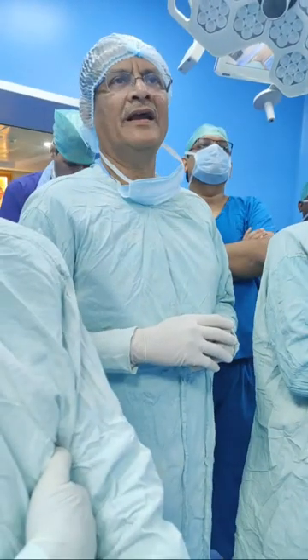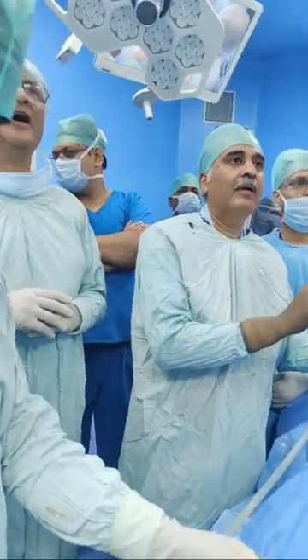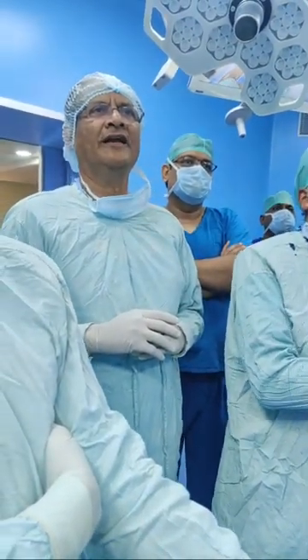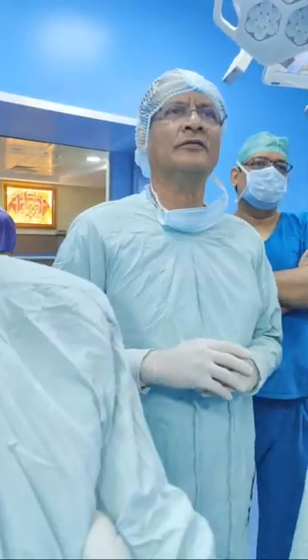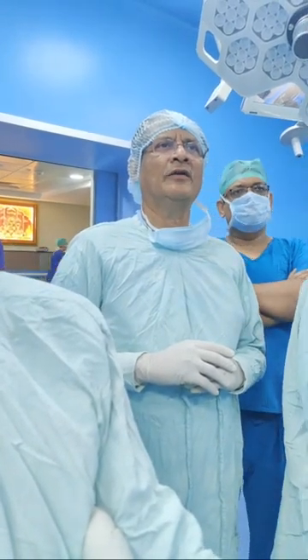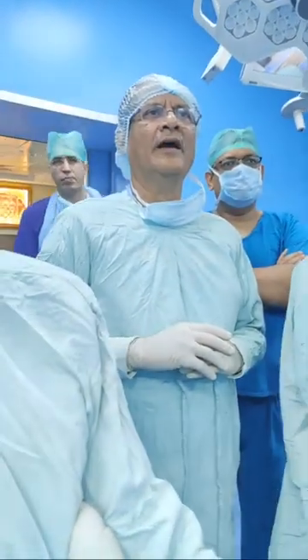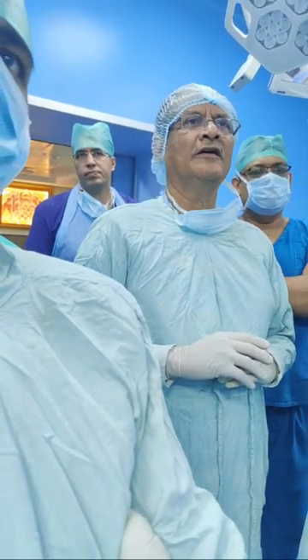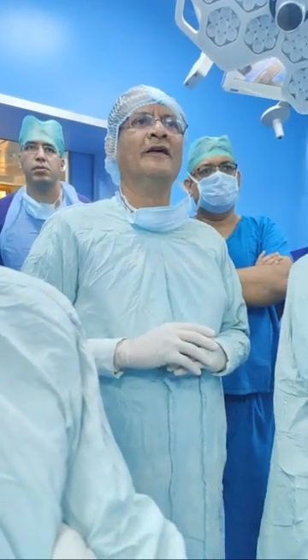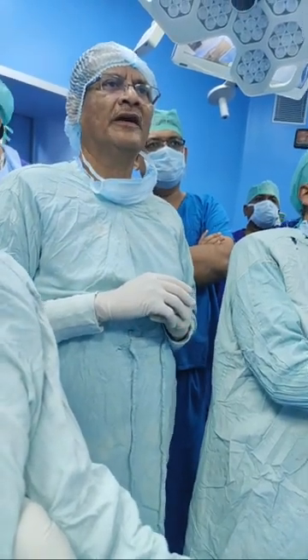Go ahead. The biggest thing about why I am here is that he also thinks about how we can reduce the track size and reduce the morbidity of a staghorn PCNL, and he realized that this is the way we can break the stones and take out the fragments very easily with reduced morbidity. India has a huge load and he has the responsibility to treat so many patients. So advocating a mini PCNL for staghorn will go a long way in reducing the morbidity of a huge population to whom he is committed. That's the reason I was reminded of how we can reduce the morbidity and do the staghorn.